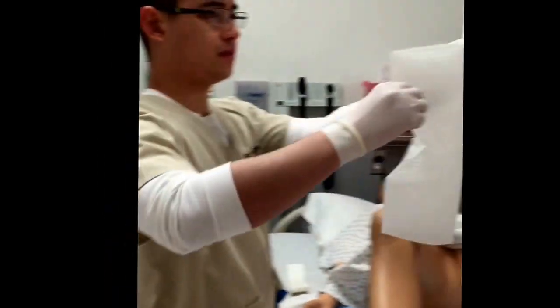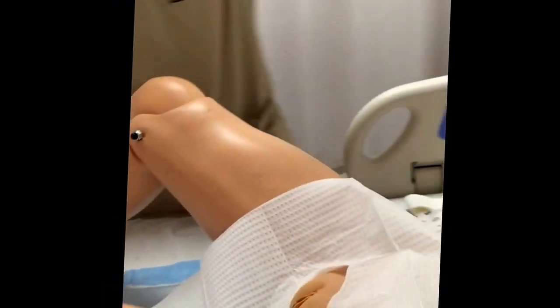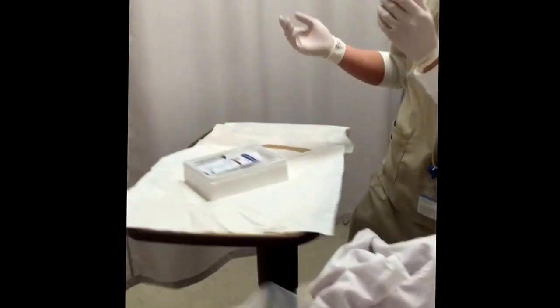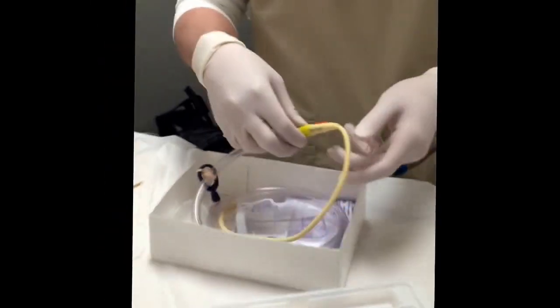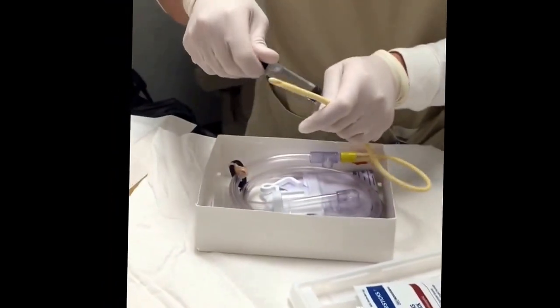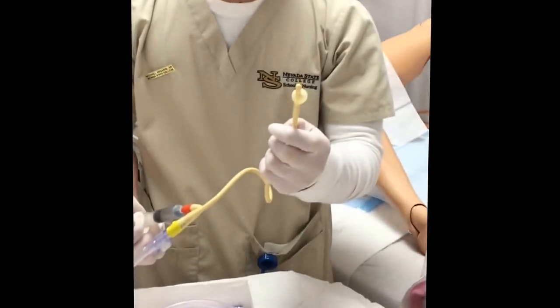So this one goes up here. So you can go ahead, pull this up here. And make sure you're not contaminating your hand because you're wearing sterile gloves already. That's good. And now you can go ahead and prepare your items. Before you start, it depends on your hospital policy, make sure you check your balloon if it's working. And make sure you're not showing it to the patient. So get one. And just prepare this. Put it on. It looks like it's working.